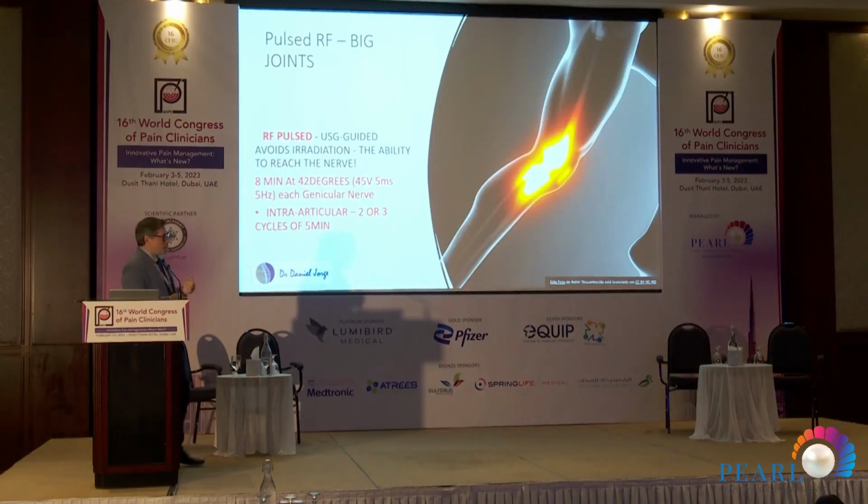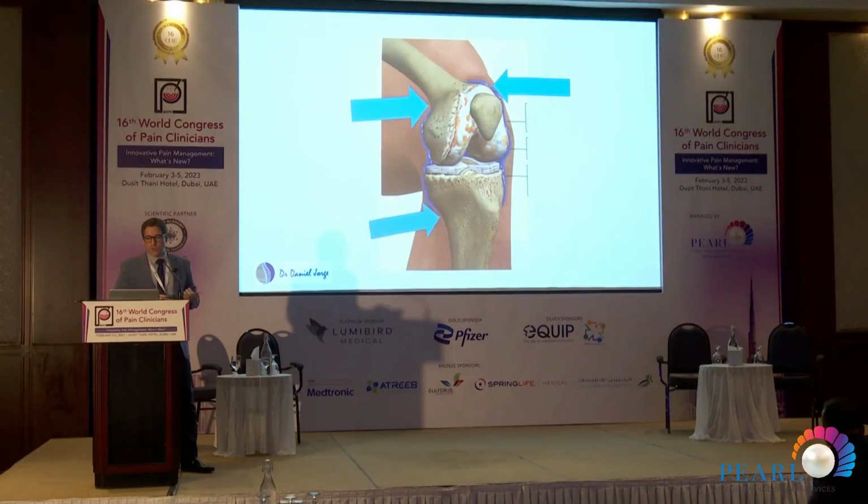So here I put some suggestions on how I use the pulse radiofrequency for the knee. You can also combine it with the genicular nerves as usual, with the intra-articular approach.